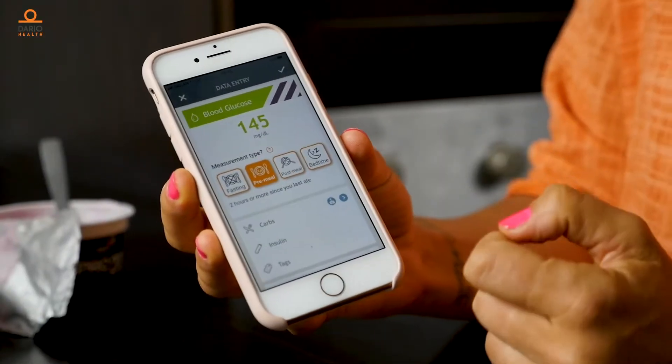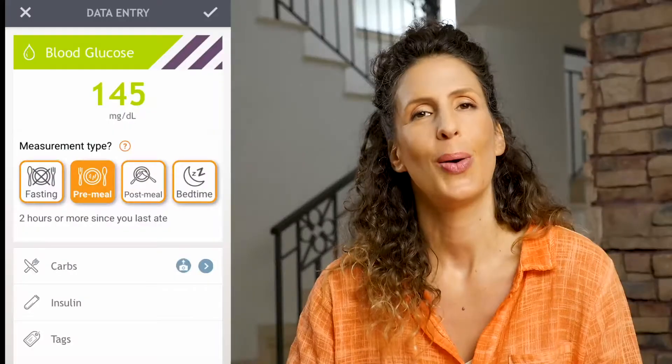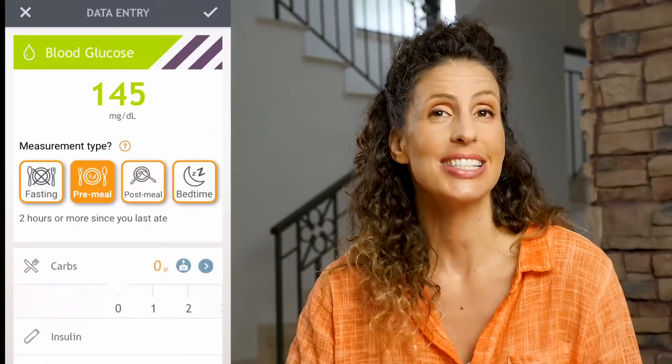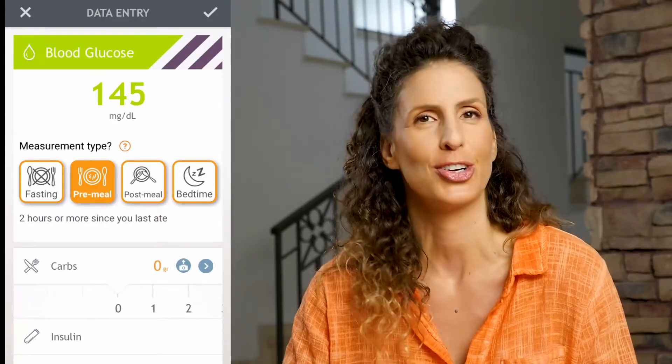The first thing to do when you arrive at the data entry page is to tag the type of reading. You can track many factors here, including carbs. When you press on the word carbs, a sliding scale appears for a quick way to enter your total carb value if you already have your carb count.